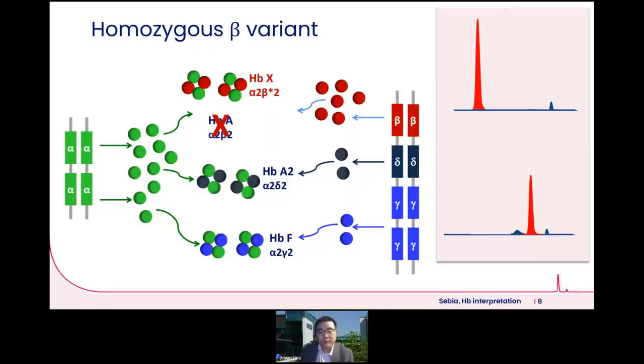What if both of the beta genes are mutated? The same mutation, of course. You would then see one major variant hemoglobin peak. Okay, and you will not have hemoglobin A because there's no normal beta gene to form the normal hemoglobin A. Okay, once again, the position of this variant peak is dependent on its chemistry, so it can be left or right of that of the normal hemoglobin A. So this is a unique feature about hemoglobin when it's on the capillary electrophoresis.